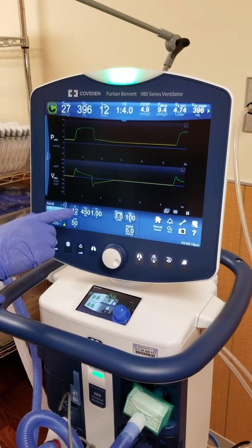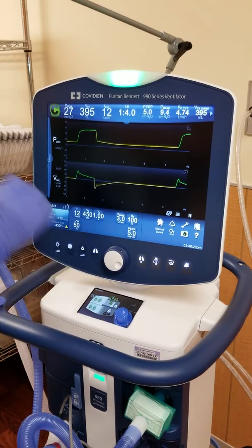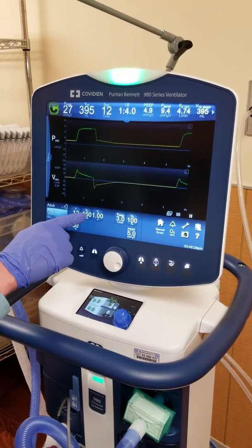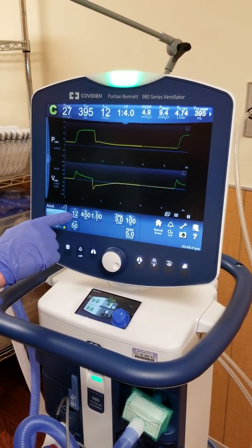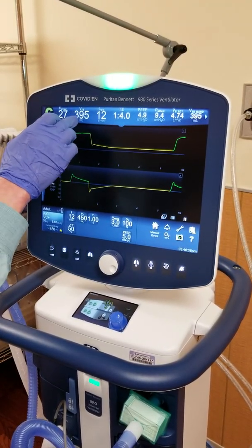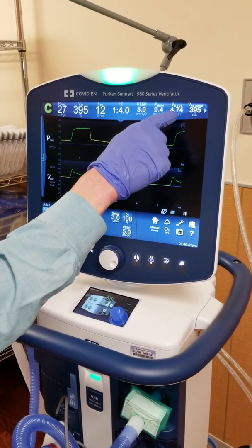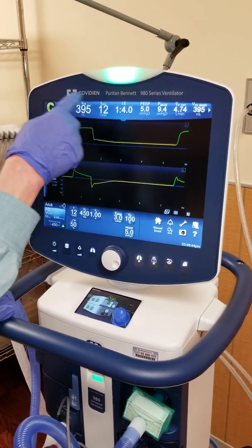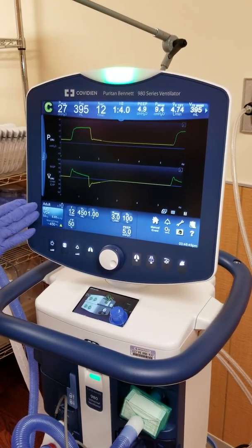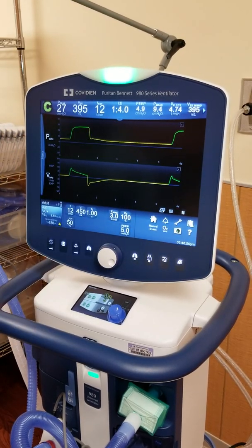Then we're going to come down to tidal volume. These are all your parameters. These are going to be your measured values up here. These are your parameters. So, you've got your tidal volume here, you got your rate, you have your FiO2, you have your PEEP. Up here, you're going to have your exhaled tidal volume. You're going to have your total minute volume, and of course your total rate. So that's how the screen is laid out. You get your parameters down here and your measured values up here. And everything in between is going to be more waveform scalers for troubleshooting.